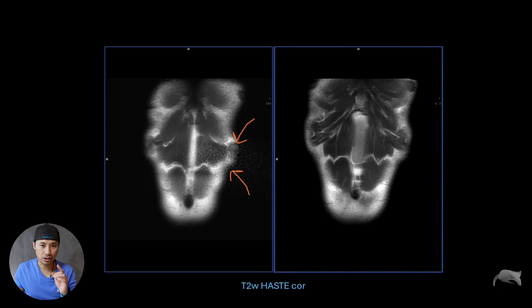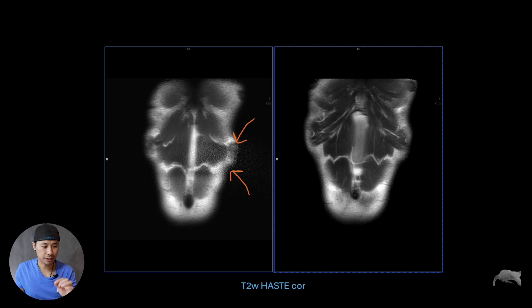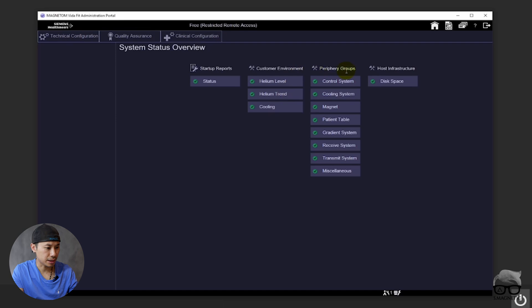So let's go to the XA software first. We'll take a look at how you can do the quality assurance in the XA software, because it's a little bit different from the older one. You're probably familiar with these icons: the system check, the syngo cockpit examination, and then you can lock the screen. So if you go into the system check, you get this.